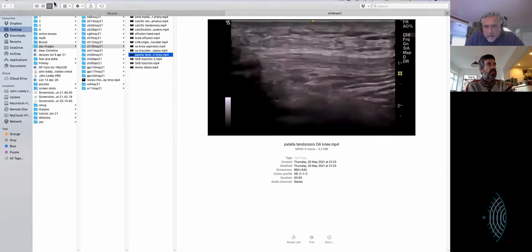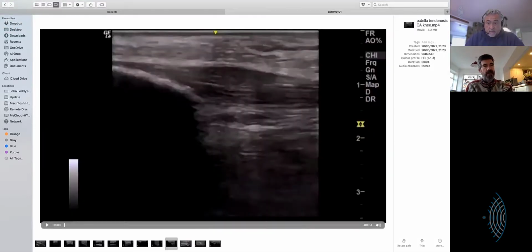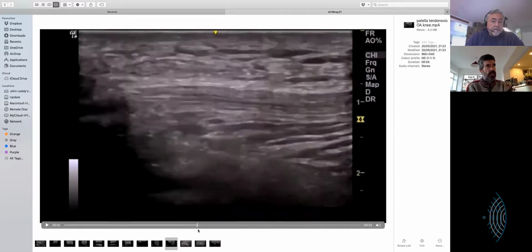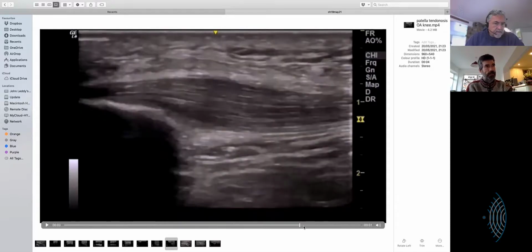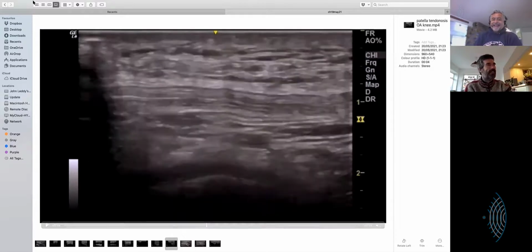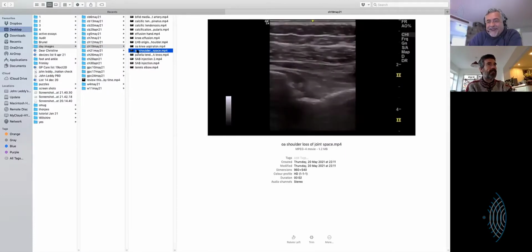This is a little bit of patellar tendinosis. This is in quite a severe OA, if I remember rightly. So it's not clinically so relevant, but certainly in my practice, I don't do a lot of sports medicine, so I don't get to see a lot of patellar tendinosis. So I'm always pleased to see it when I see it. Like proper MSK ultrasound. Proper.